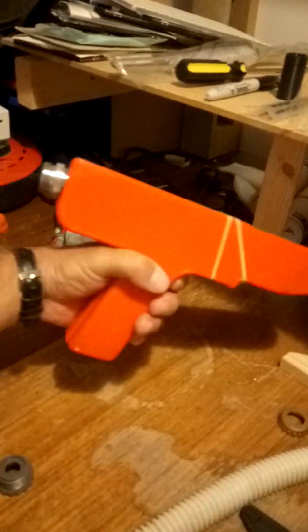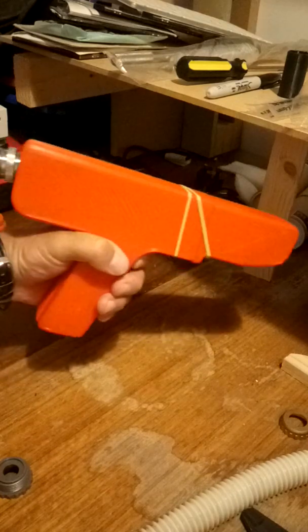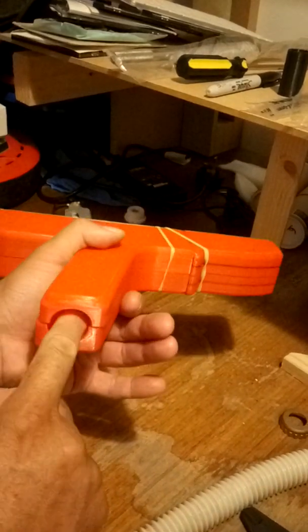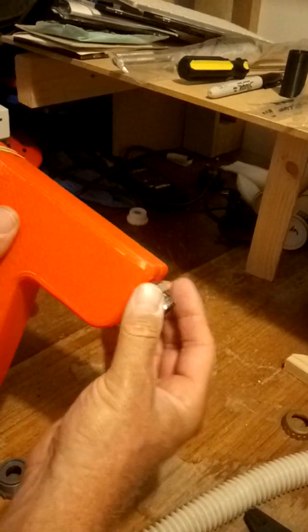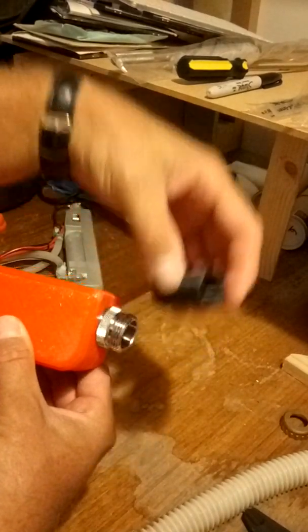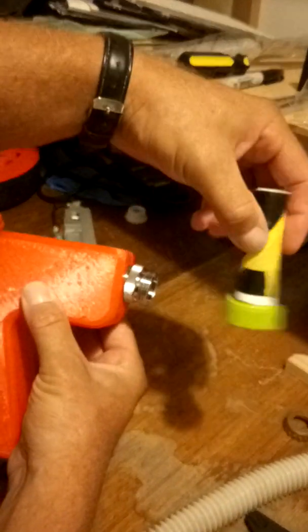Now the next one I'm going to make will have the hole at that end, so it looks a bit more realistic, like a gun, if you imagine. But this isn't a gun, it's just a handle. So this is where this tube goes into. That's where we're going to connect the tubes on the end, for example, like that, or the filters. We've got 1064, 532 and 1320 nanometers, and that will go on there like so.